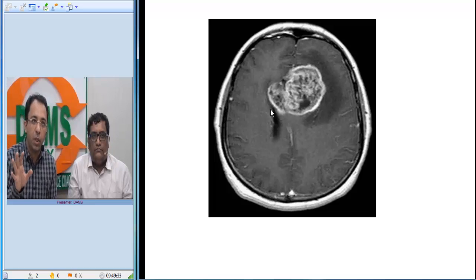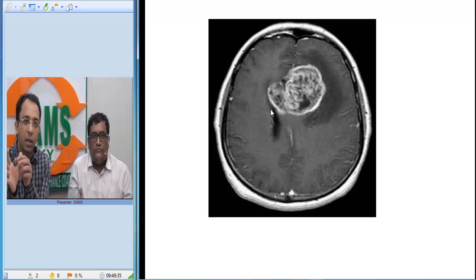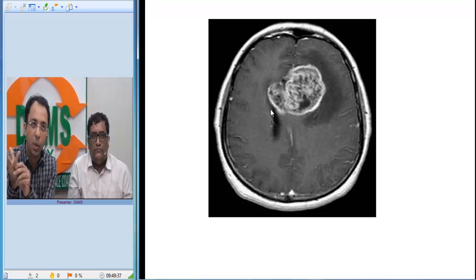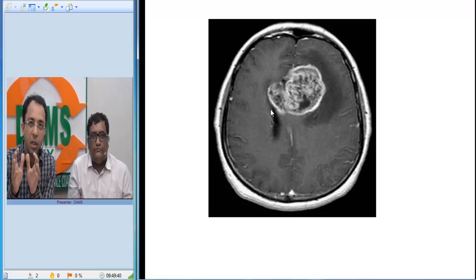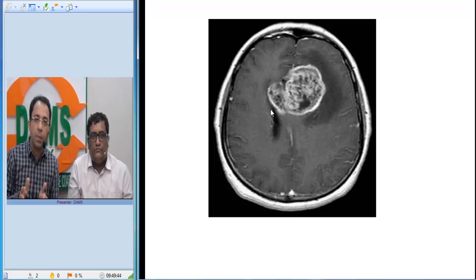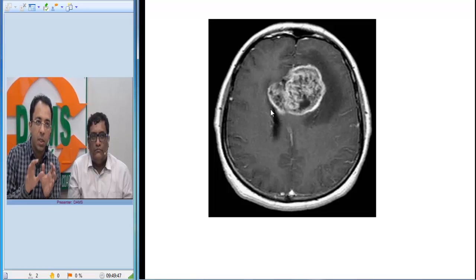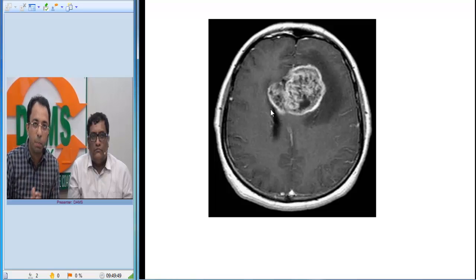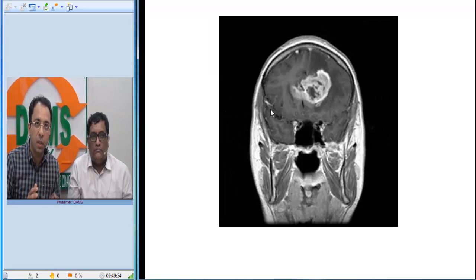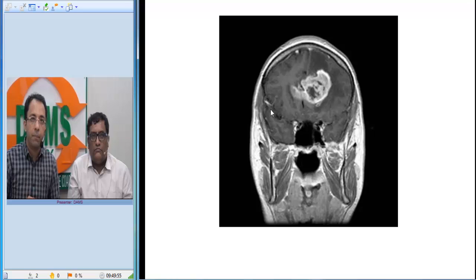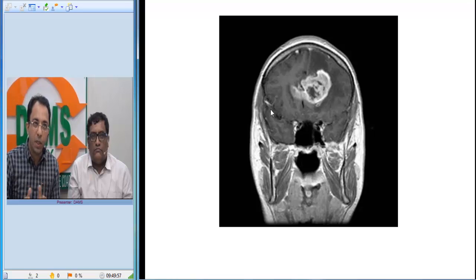Features pointing towards high-grade malignancy are rapid onset, extensive surrounding edema, necrotic areas, heterogeneous enhancement due to disruption of the blood-brain barrier, and crossing the midline. This appearance in radiology is called the butterfly appearance — we call it butterfly glioma — and the differential diagnosis would be GBM, glioblastoma multiforme.